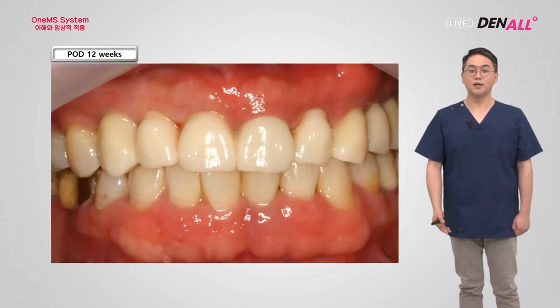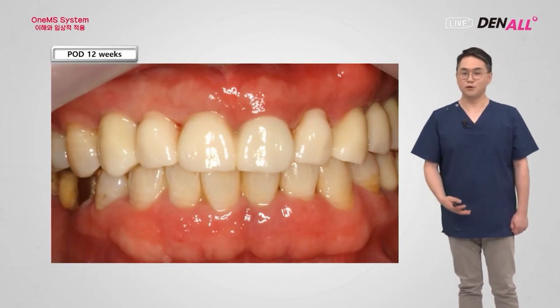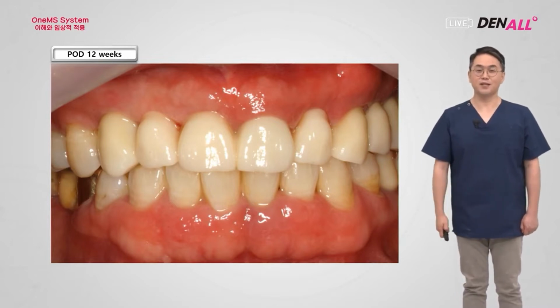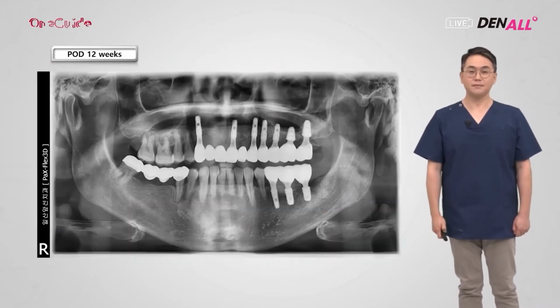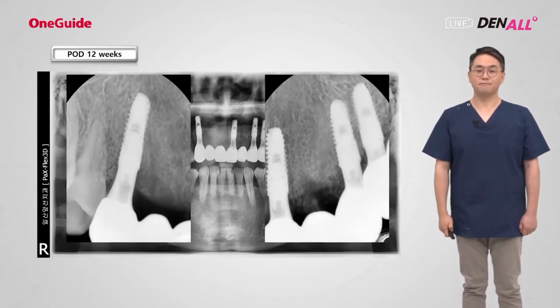To place the implant, I did not use a blade or do any suturing because the flap was not opened, and that is the strength of guided surgery. This is after delivering the final prosthesis.